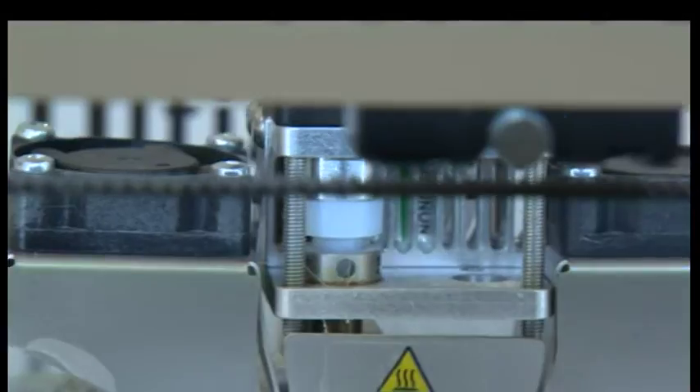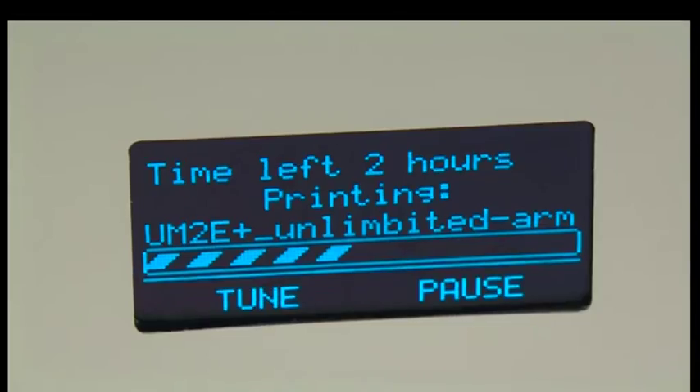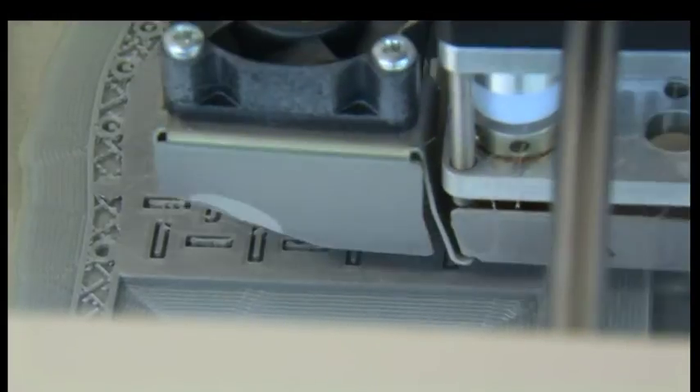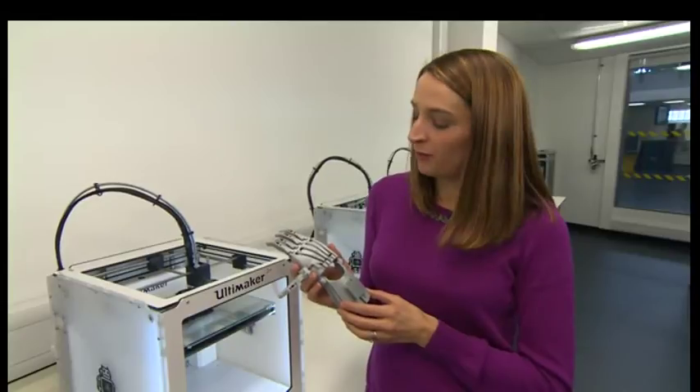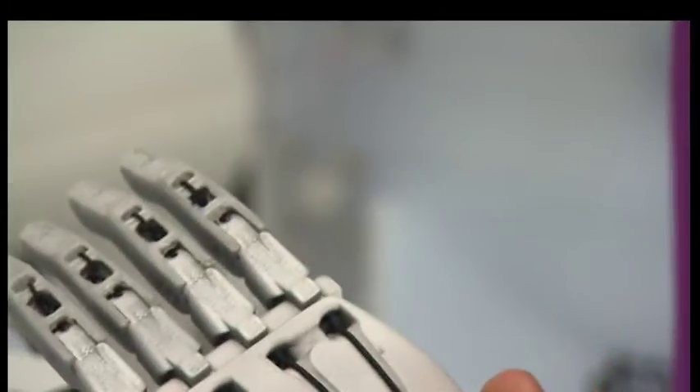And how long do these printers take to make these? This one right here is going to take 11 hours — they do take quite a while. But in a couple of years' time, this will be done in 11 minutes. The NHS pays thousands of pounds for prosthetic hands, but using these 3D printers, this costs around £35.